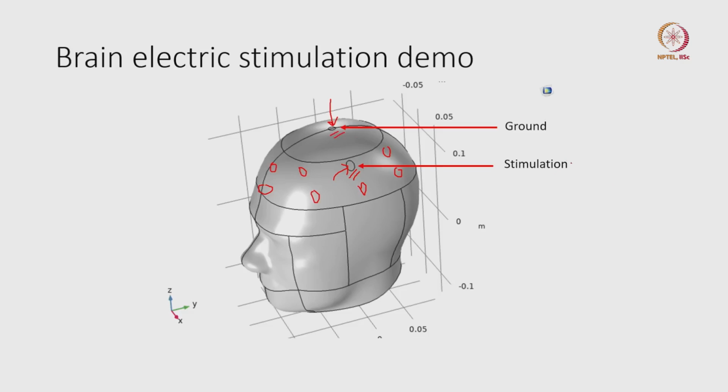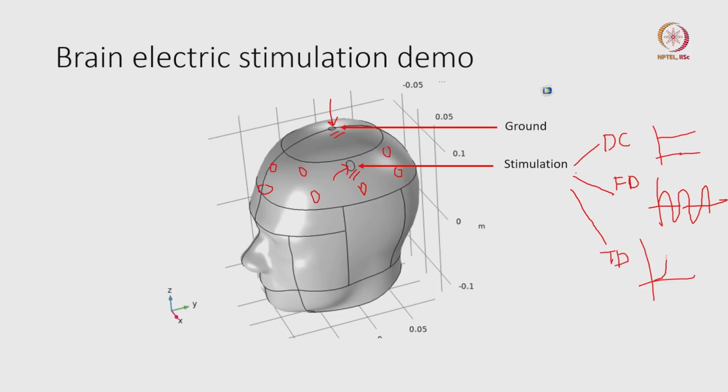Again, the stimulation could be various. You can start with a DC signal, maybe 10 millivolts or so, or you can do a frequency domain study, where you stimulate with certain frequencies, or you can do a time domain simulation, where you give a Gaussian impulse, a Gaussian pulse of very short duration, to see how the stimulation is going to affect the tissues within the brain.